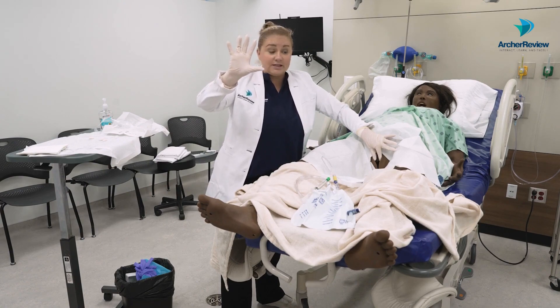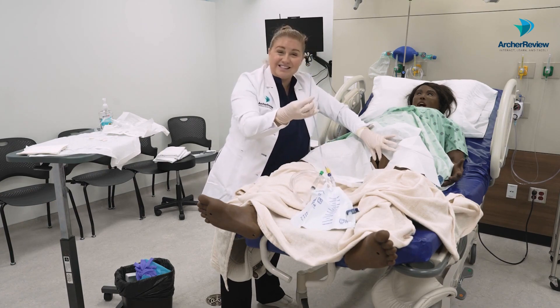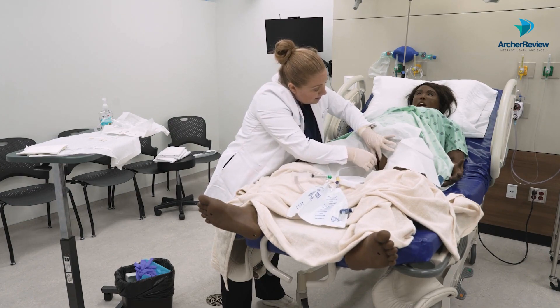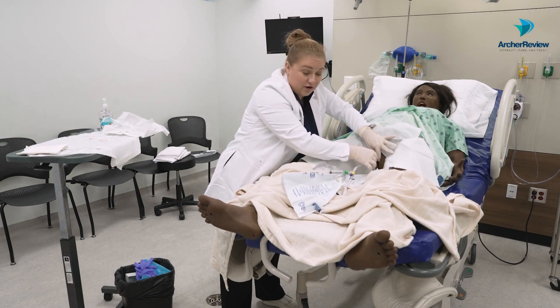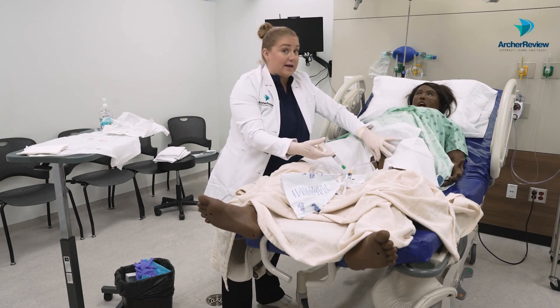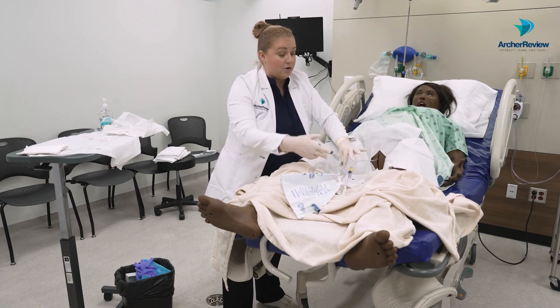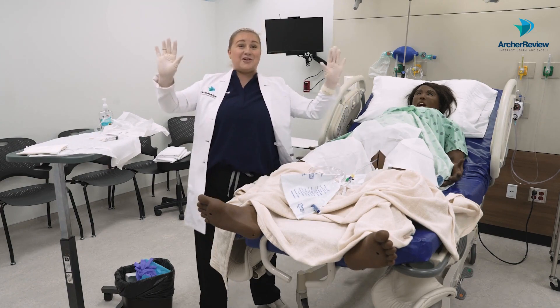This hand has only touched those swabs. I can now pick up the catheter that is sitting in the lubricant, find the urethral meatus, and insert. I'm going to go until I see some urine, and then just a little further. We're going to say that's right where it is. We're going to inflate our balloon, keeping note of how many cc's we put in that balloon before we take it out because we're going to want to note that on removal. We've got urine, we've inflated our balloon.